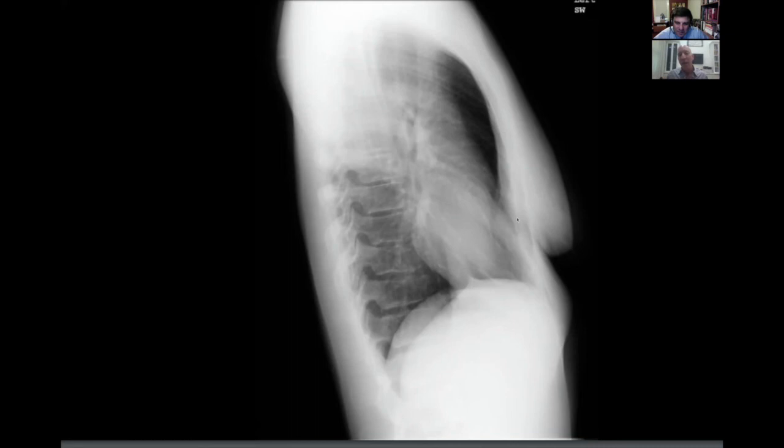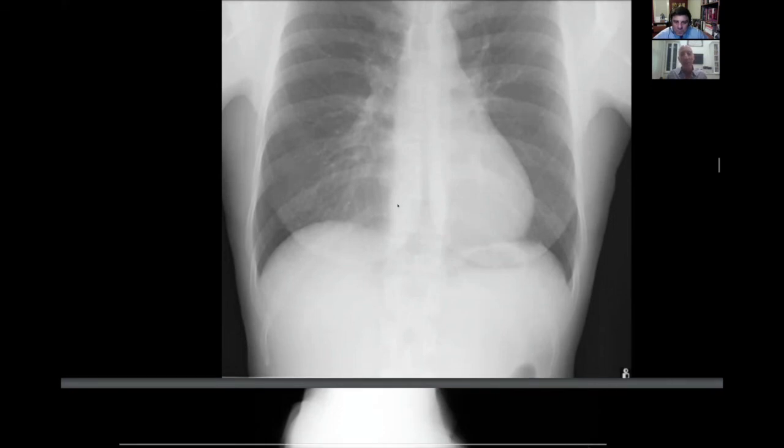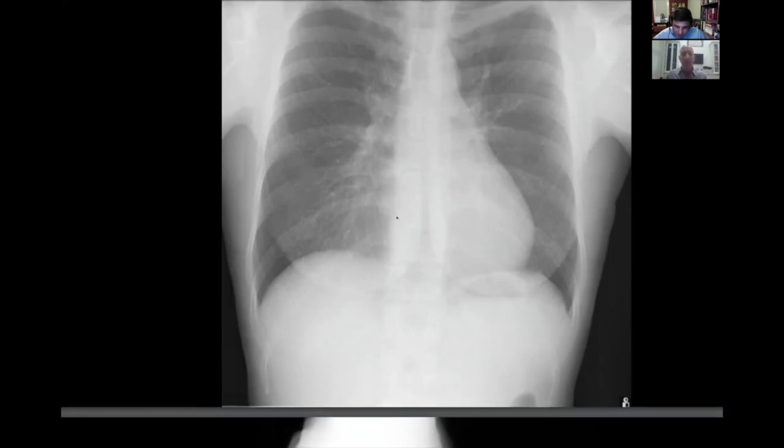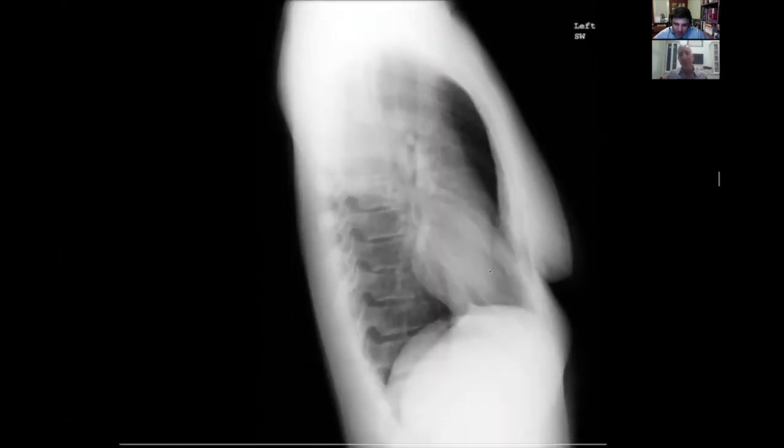Is that what I'm seeing on the PA view? Yes, exactly. Anytime you get a pectus deformity, this is what's going to cause this increased density and obscure the right heart border. Sometimes it could be a lot more pronounced, but just be aware that this could be a mimicker of infiltrate, and of the importance of making sure you have a good lateral view and recognizing a pectus deformity as a cause. That's a really good tip. I'm sure that I've seen that, and I probably overcall the right middle lobe because of it. So I appreciate it. Awesome.